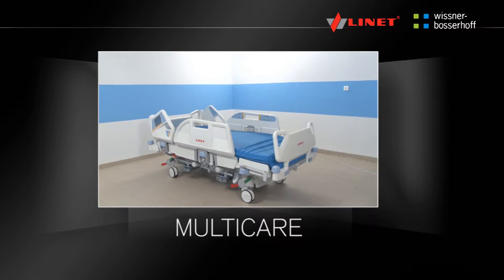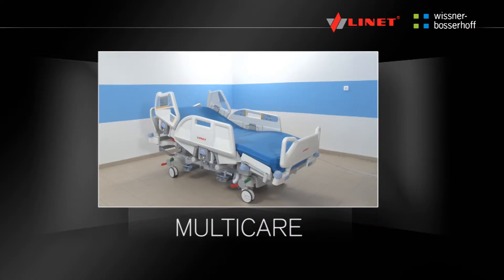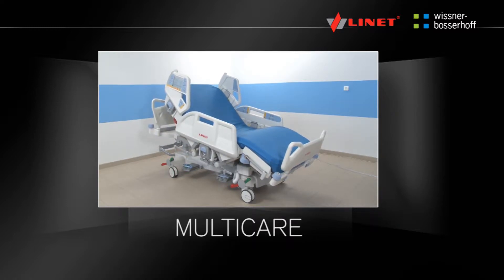The MultiCare is a fully profiling electric hospital bed intended for critical care facilities and intensive care. The MultiCare has integrated scales and an X-ray cassette holder for chest X-ray examinations.